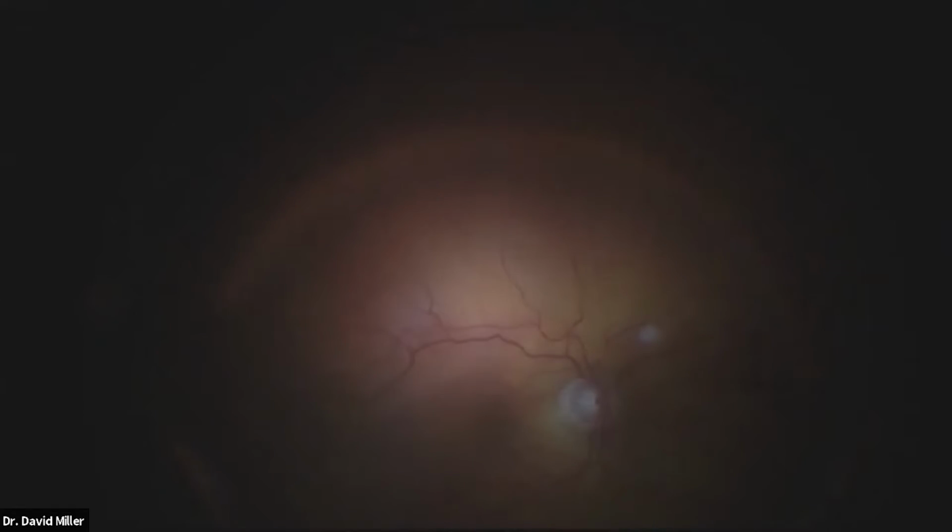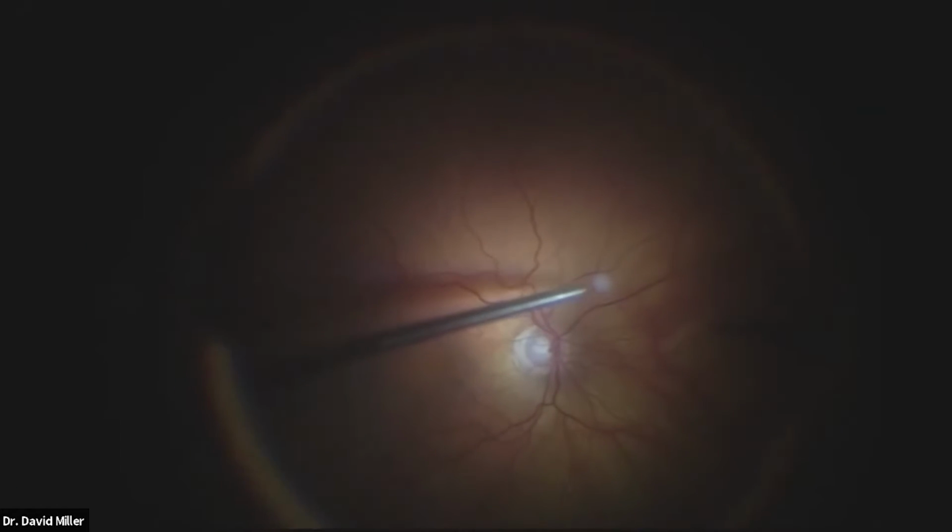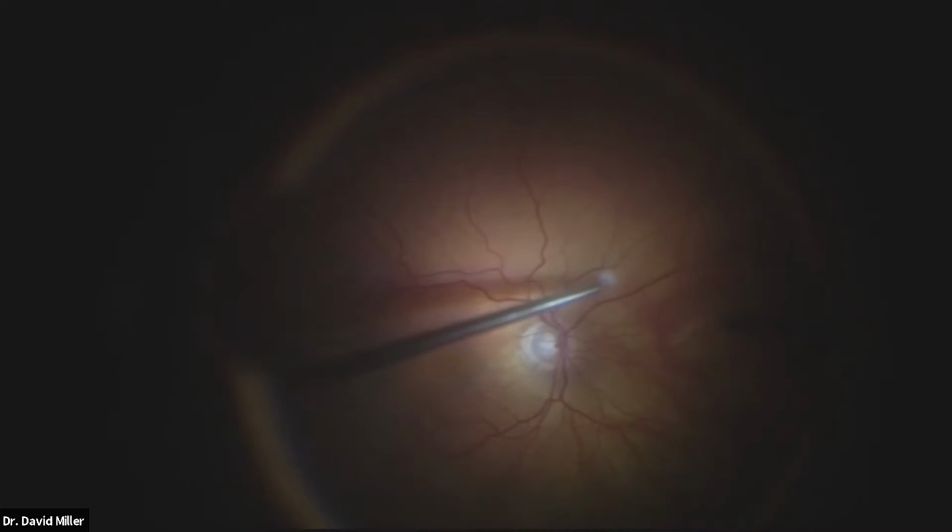We're going to drain out the retinal detachment here, apply our laser shortly after that. So the retinotomy is quite often less simple than it looks. You see the white area, there's lots of blood vessels around it. There always are if you're posterior. And people too often, these retinotomies get away from them. They enlarge and there's bleeding.